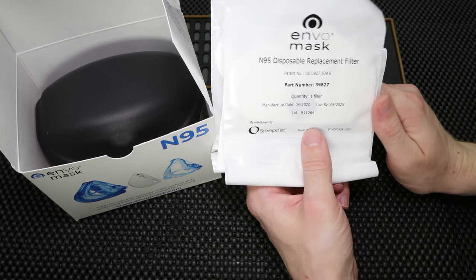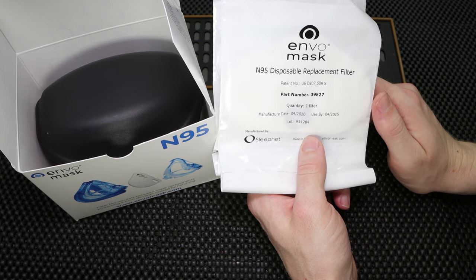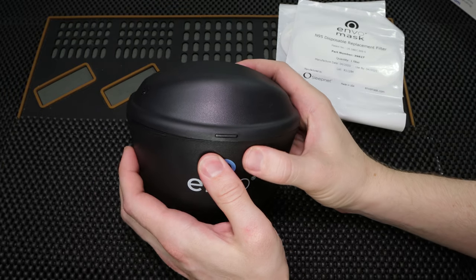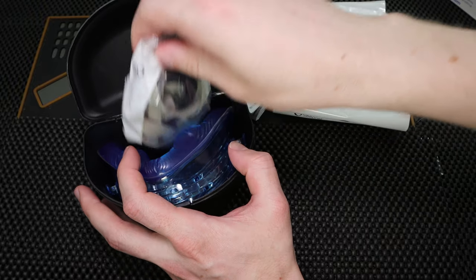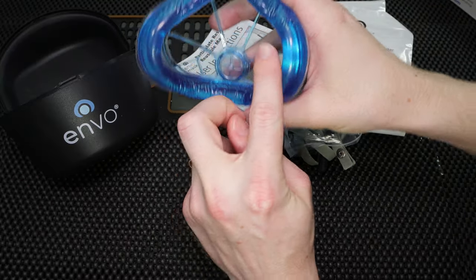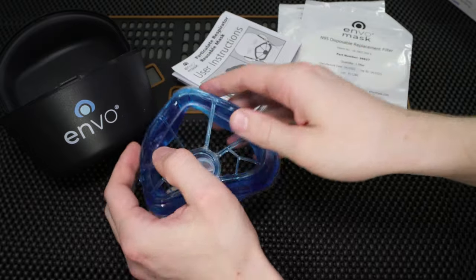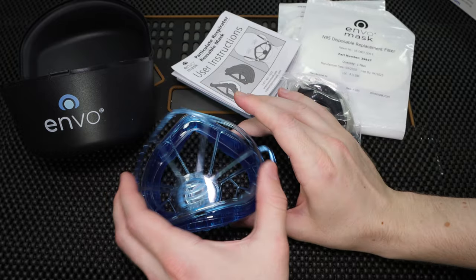Essentially what you do is you just continue to wear the filter until you feel like it's a little bit harder to breathe through, and then that's an indication that it's time to change. Once you open up the box, you're also going to see this really cool case that it comes with. The mask has its own custom container, and when you open it up, you're going to find the instruction manual, the straps to hold the mask on, the bottom piece of the mask which has the air gel — which makes such a nice seal and is so soft. I'm starting to get a little pressure ulcer right on the bridge of my nose from using traditional N95 masks. And then there's the front plate that's going to hold the filter in place.